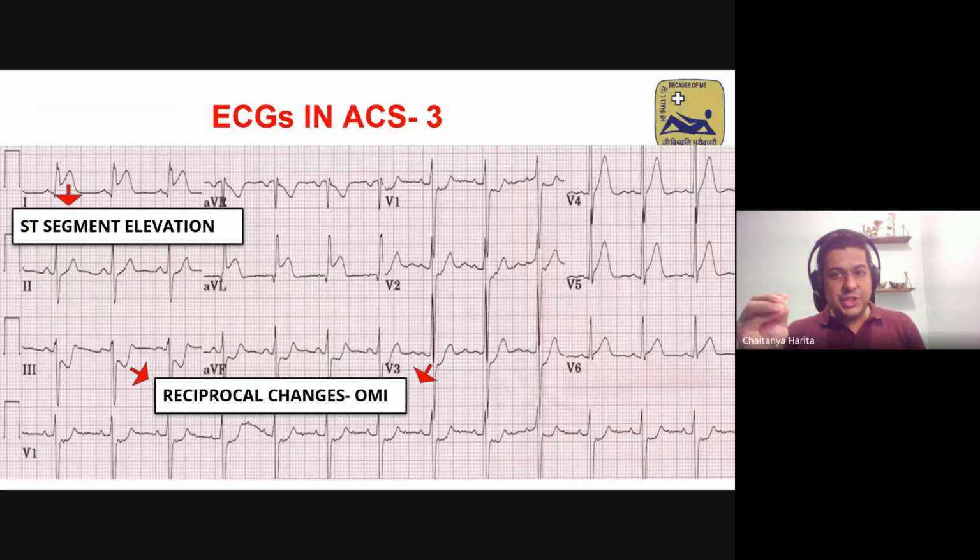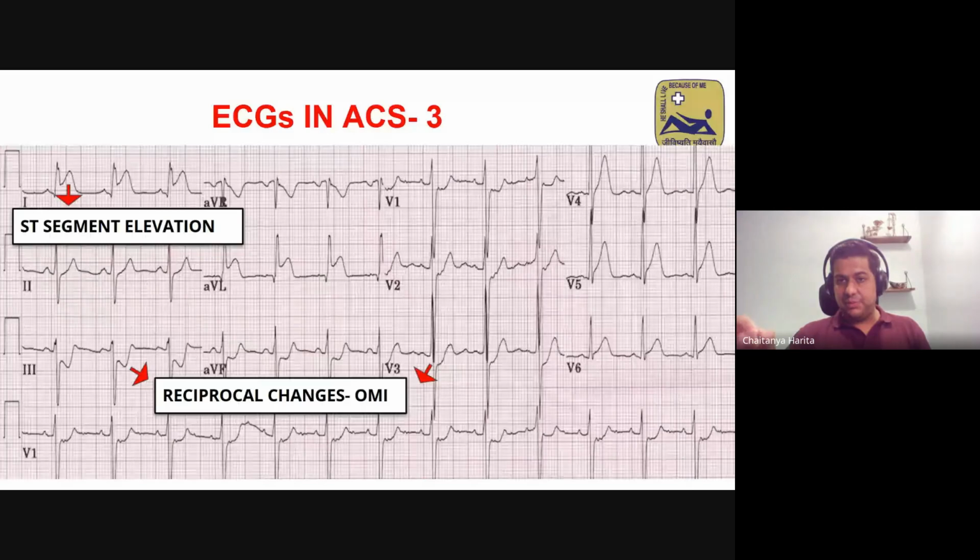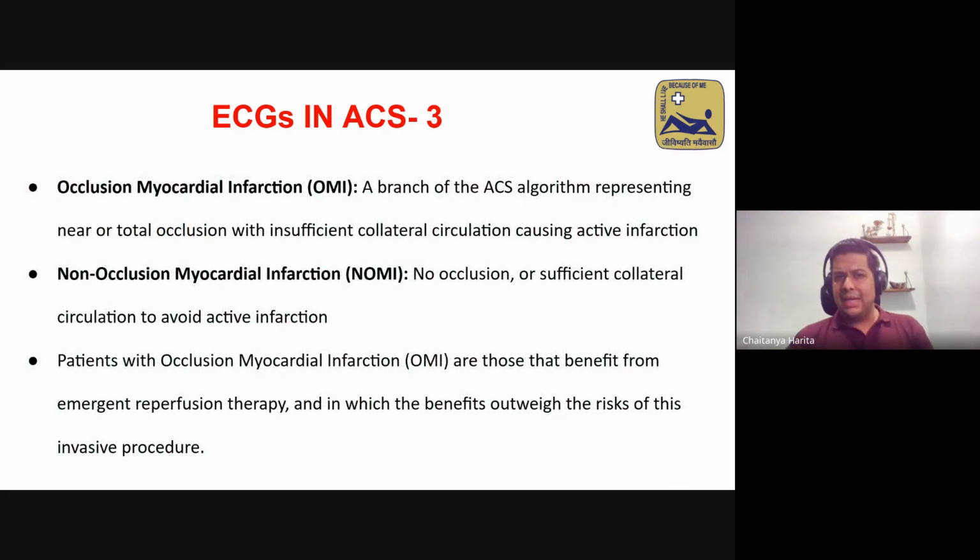Does it change your management? No. Will you still give loading dose of statins and antiplatelets? Absolutely correct. But this tells you that this is an occlusive myocardial infarction. So the urgency to shift a patient for thrombolysis or to a nearby center for percutaneous coronary intervention or angioplasty is paramount. Whenever you see OMI changes, please ensure that the degree of urgency you show to refer them is much higher.